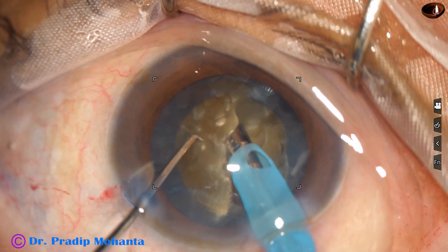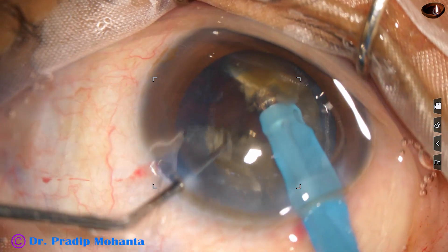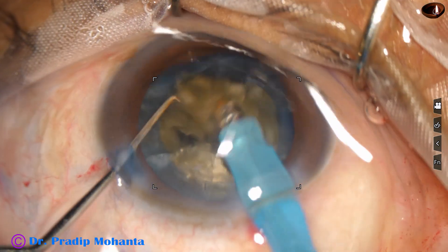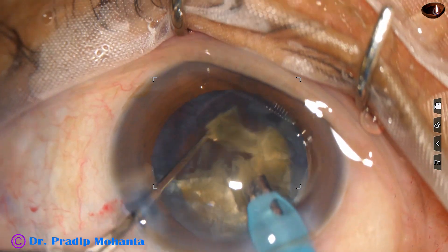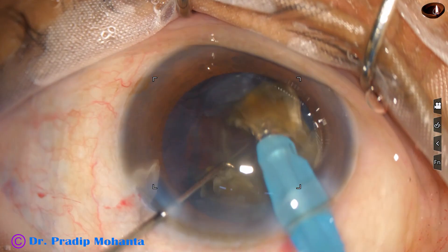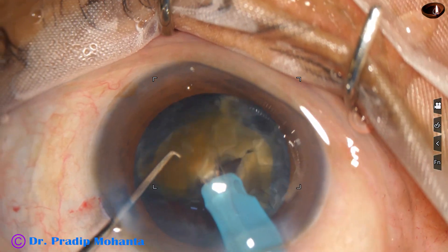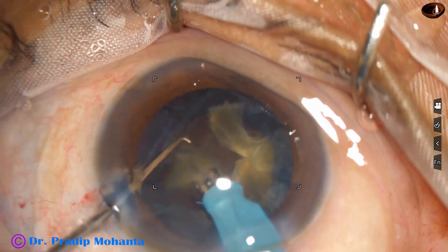Now my plan is to divide this semi-nucleus into three to four fragments. The first fragment is big, so I divide it again into two pieces. Ultrasonic energy being used is 85 percent in continuous mode, flow rate is 45 ml per minute, vacuum is 450 mmHg. After getting the fragments, they are emulsified by the same setting, except for the last piece where the parameters will be reduced.